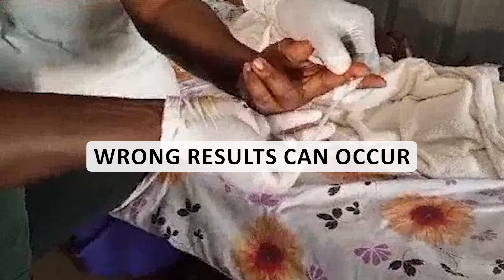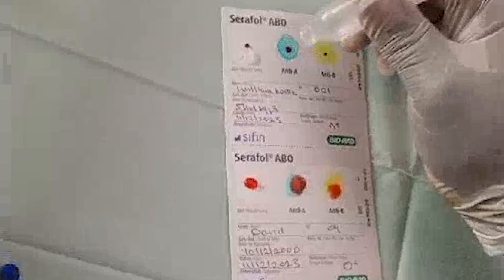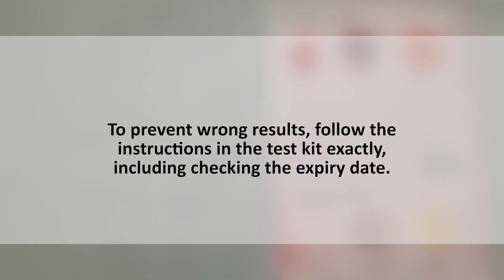Sometimes a wrong result can occur. One cause is when the blood drop is too small or too large. Another is when the blood mixes with the dry reagent on the paper without saline or water. To prevent wrong results, follow the instructions in the test kit exactly, including checking the expiry date.